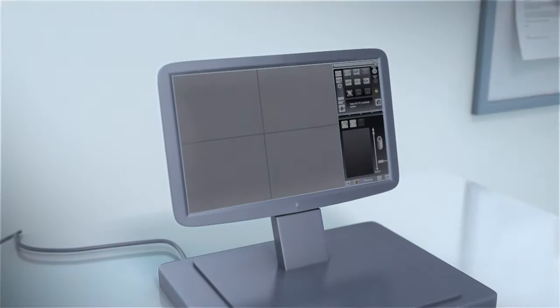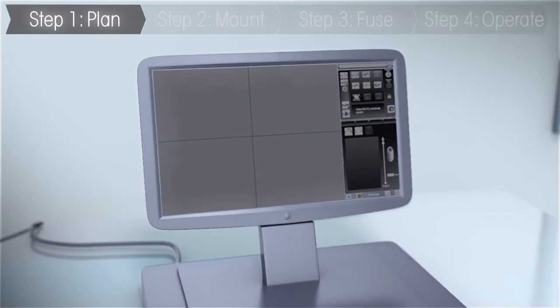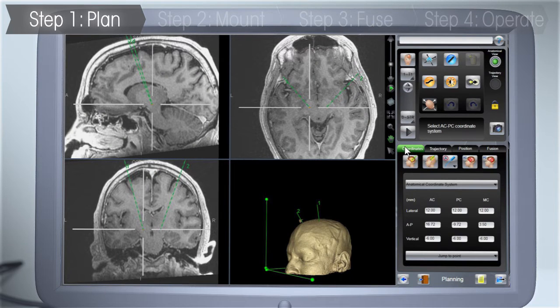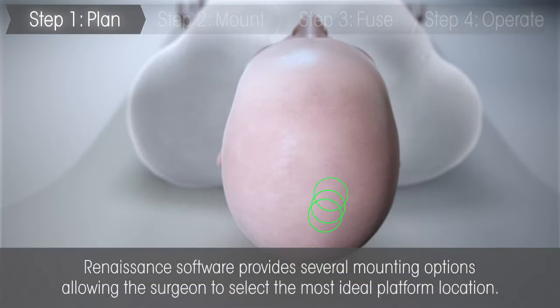A Renaissance brain procedure begins with a preoperative MRI scan of the patient. The scan is uploaded into Renaissance's preoperative 3D software for surgeons to plan the optimal trajectories prior to the procedure. According to the planned trajectories, the software provides different options for the most ideal platform location.